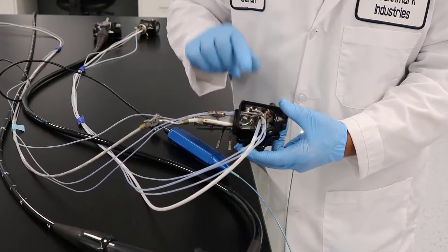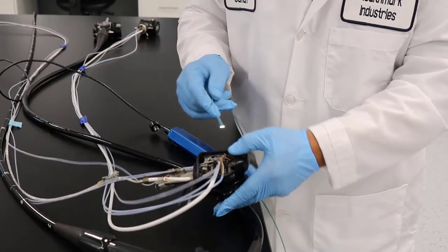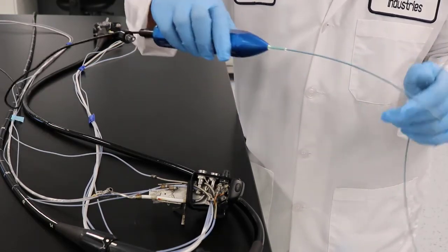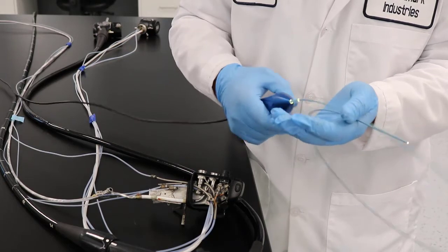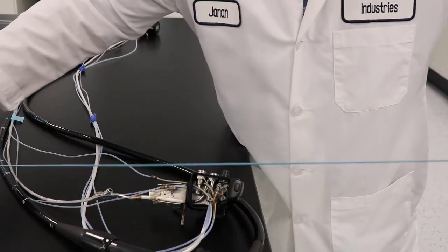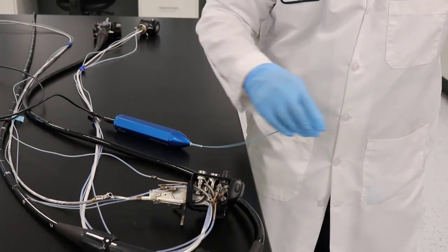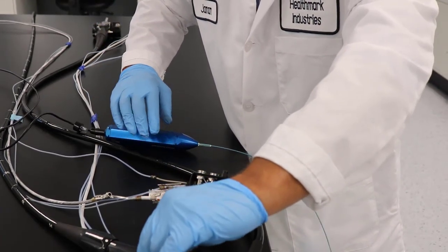The whole idea is: when you encounter resistance, stop — because that means either you have a damaged scope or you are in an area you shouldn't be in. We've been receiving scopes that got damaged because somebody forced the scope into these areas. We also get scopes damaged at the distal end because someone put too much pressure on them or pushed too far, damaging the fiber optic. Make sure that if you encounter resistance, something is going on — don't force your scope in. Don't push it too far in at a tight angle. Lay it straight on a flat area, and if you need a difficult angle, have another person assist, but don't over-bend it and damage your flexible scope.